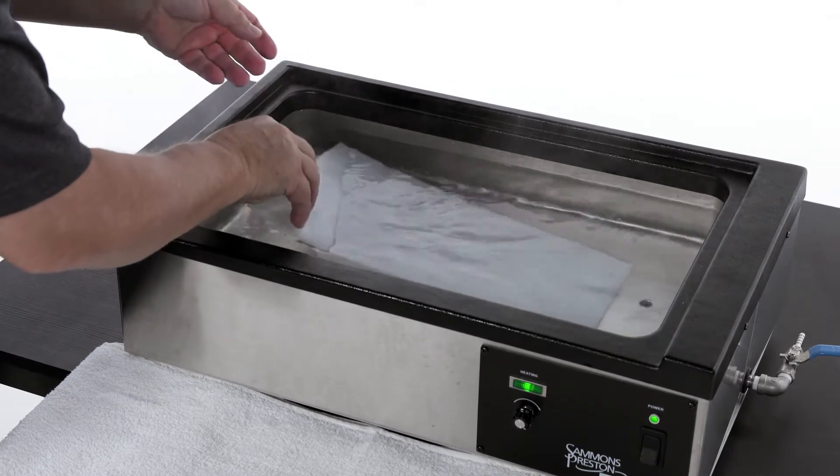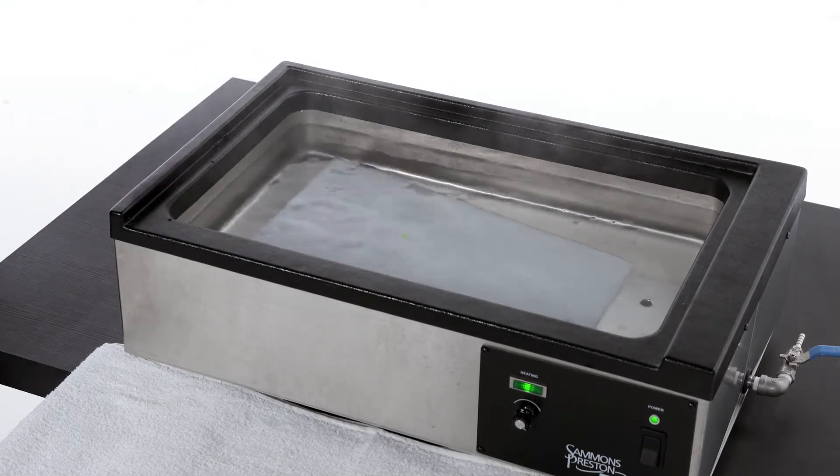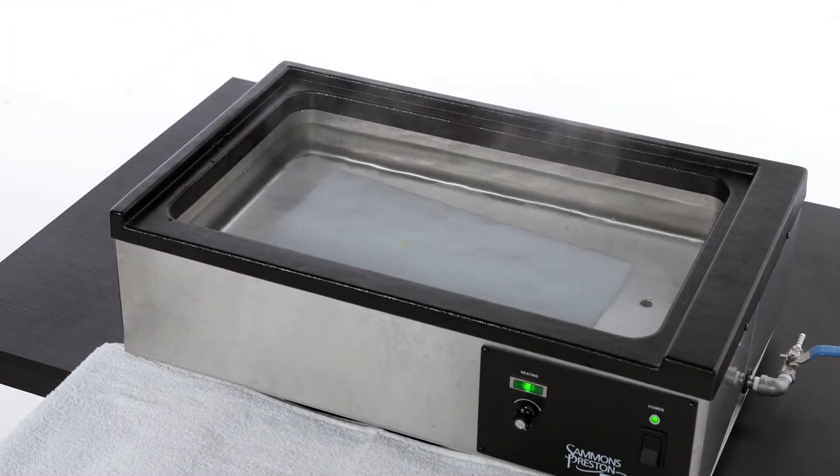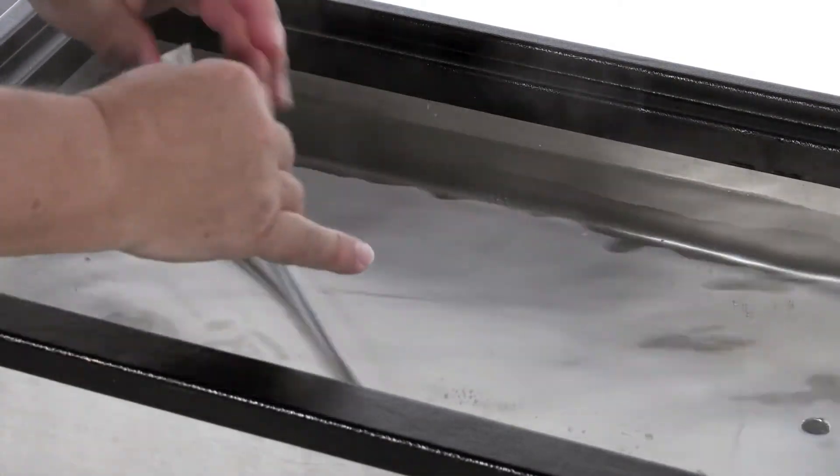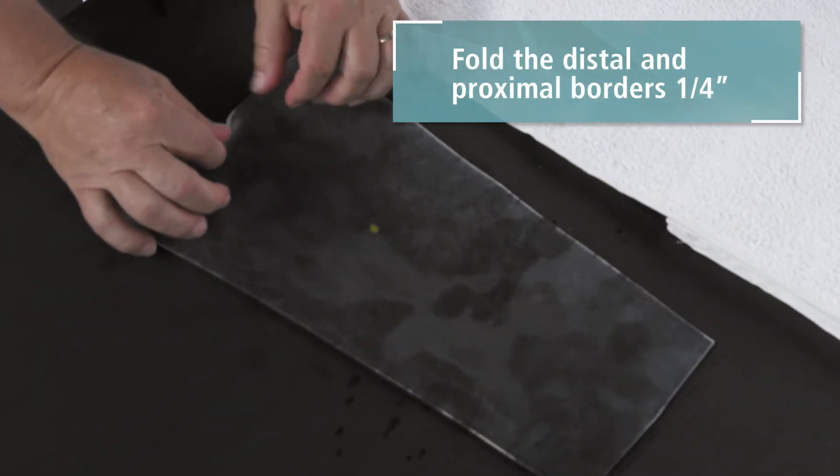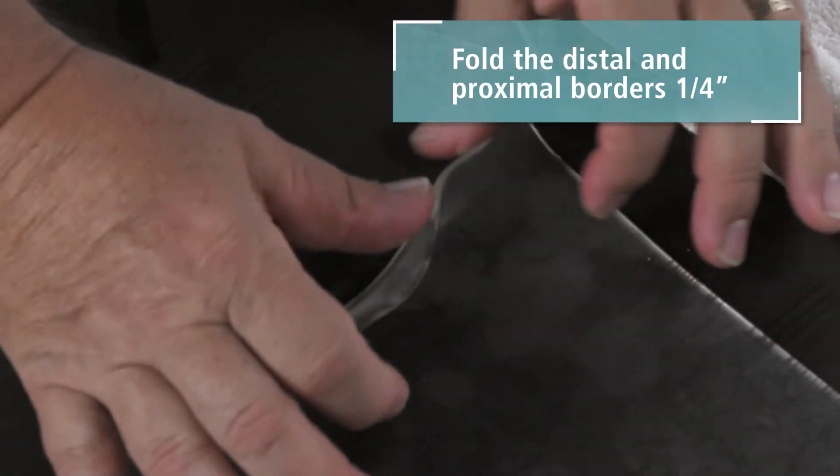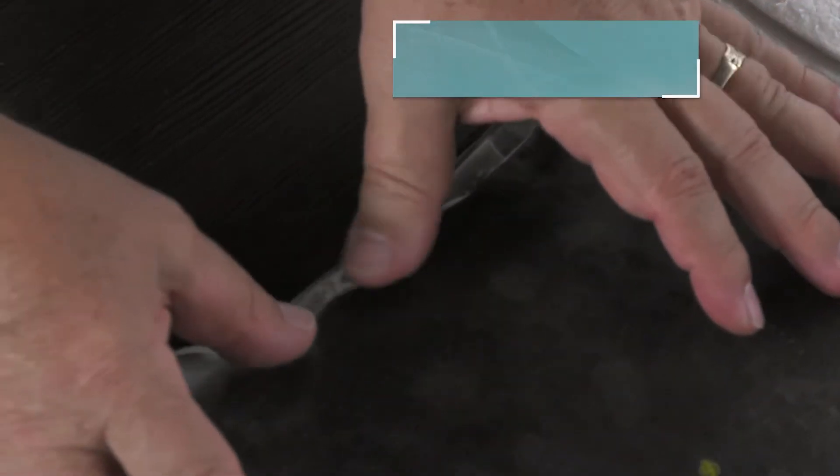Place the material in the splint pan for approximately 1 minute or until it is transparent. Remove the material from the splint pan and fold the distal and proximal borders 1 quarter inch, pressing on the folds to ensure they remain folded.